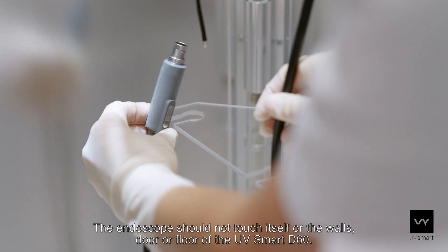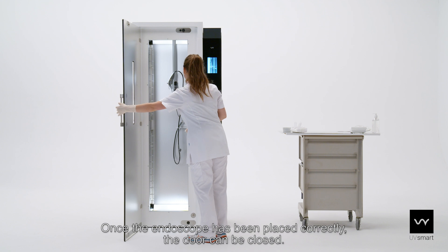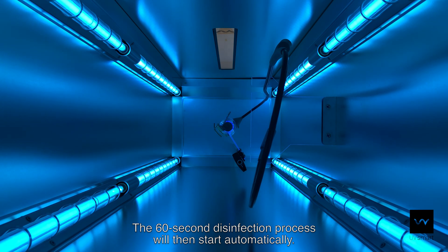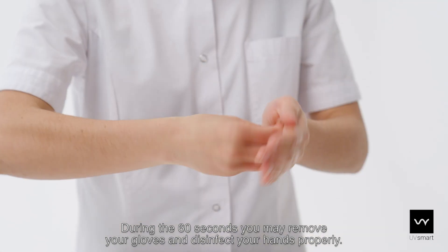The endoscope should not touch itself or the walls, door or floor of the UV Smart D60. Once the endoscope has been placed correctly, the door can be closed. The 60-second disinfection process will then start automatically. During the 60 seconds, you may remove your gloves and disinfect your hands properly.